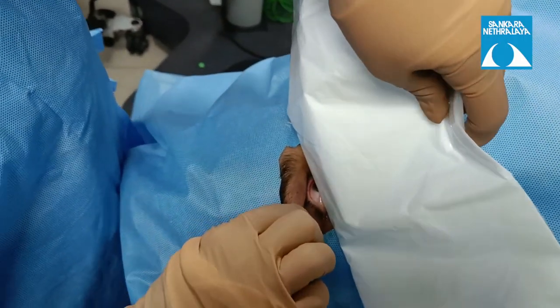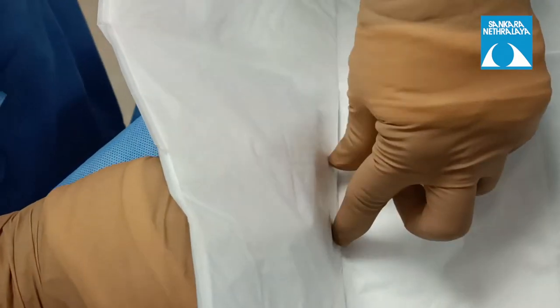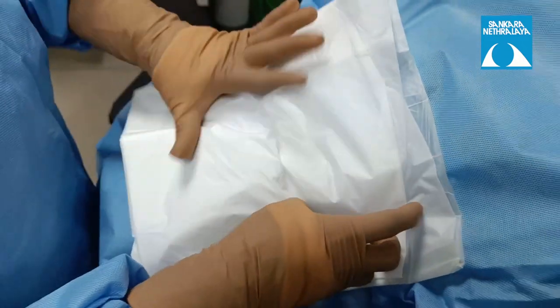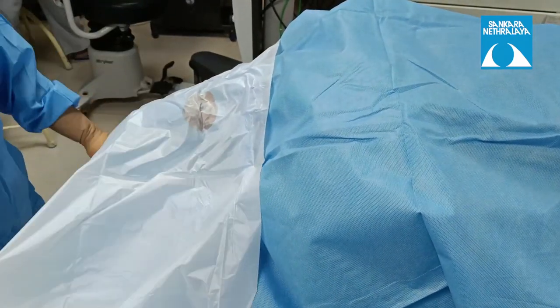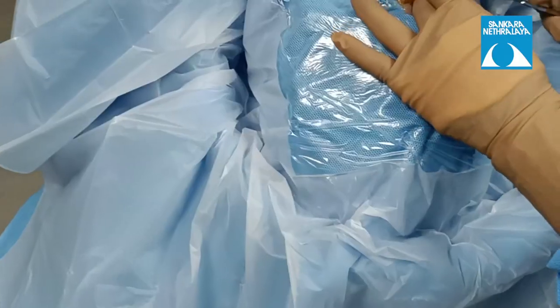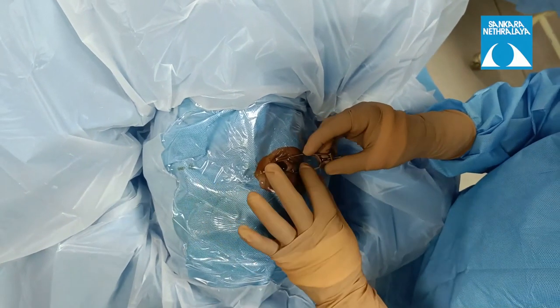The transparent drape is then placed with the broader end on the surgeon's side, by opening the upper lid carefully and placing it just above the inferior lid to make sure all eyelashes are well covered. The drape is pressed from medial to lateral to ensure the medial side is well adhered to the skin and prevents fogging later on. The transparent drape is opened up and spread over the first drape, then a central cut is made in the palpebral portion to release the drape in the palpebral area.